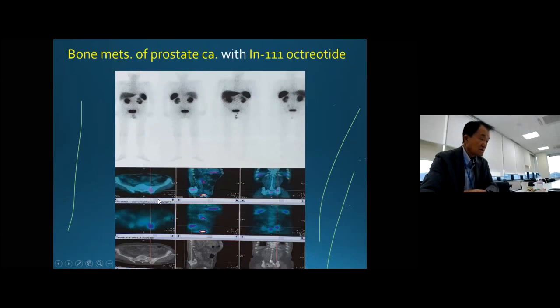There's a bone structure here. This is called the iliac tuberosity. On the posterior view, you may see asymmetry. The iliac tuberosity is up way back, so anterior doesn't show it, but this one does. So on planar, you may suspect something here, but obviously you require SPECT to correlate.